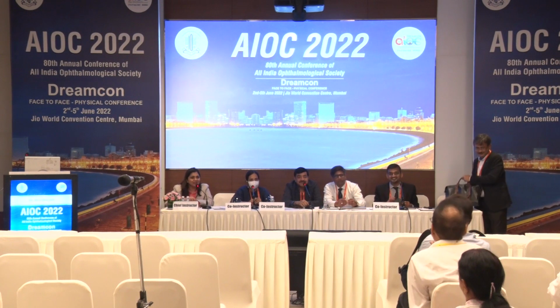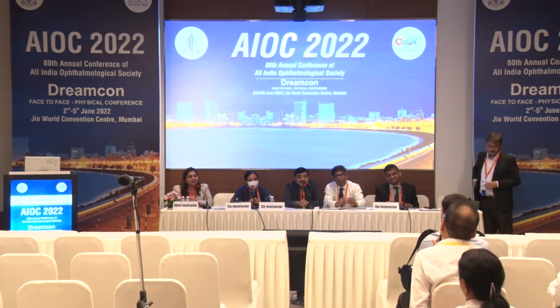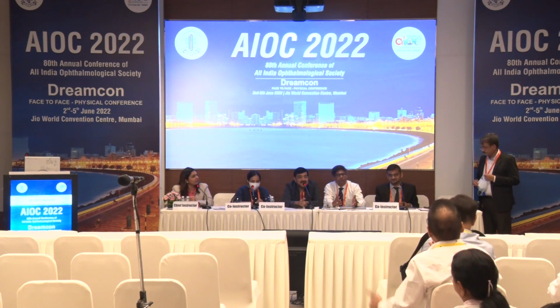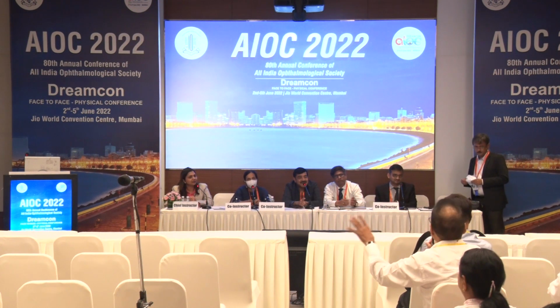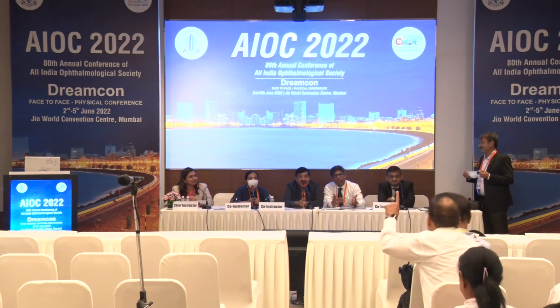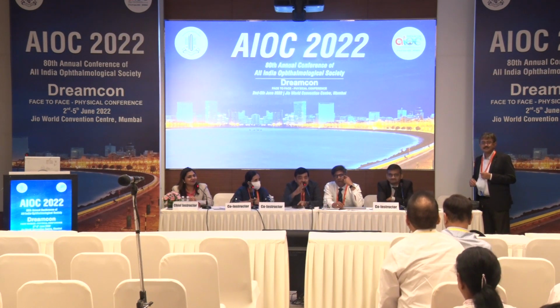Yes, there is a question. Yes, sir, please. Suppose there is a significant residual astigmatism and you don't want to rotate or go again to the OT and do intra-ocular correction. How do you tackle that? If the patient is unhappy, a toric, multifocal toric patient, both eyes done, one eye excellent, in the other eye there is a residual astigmatism of say 2.5 cylinder, and the patient is unhappy, you have to do something. Are you talking of LASIK or bioptics?